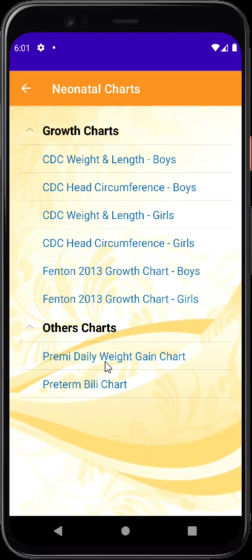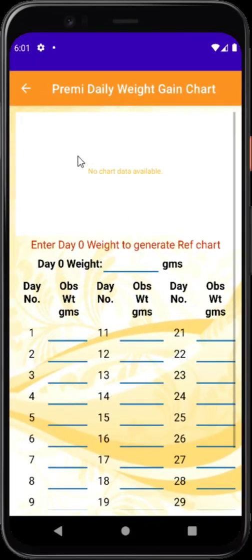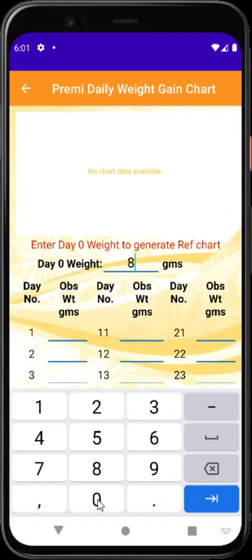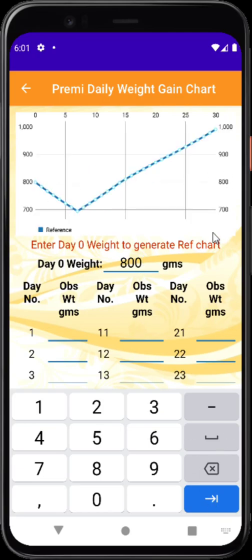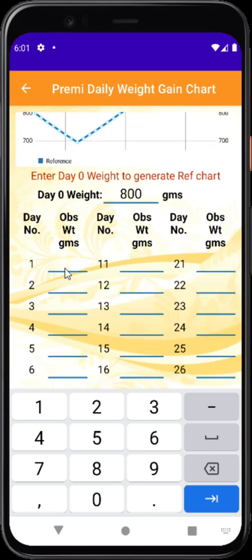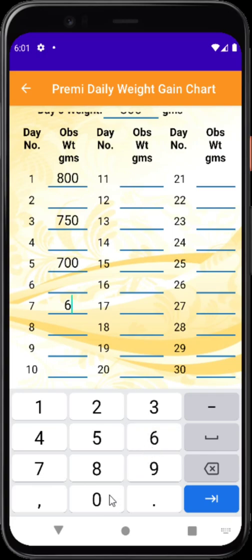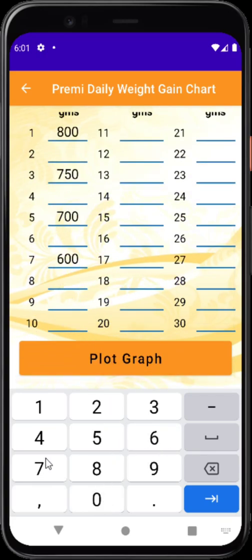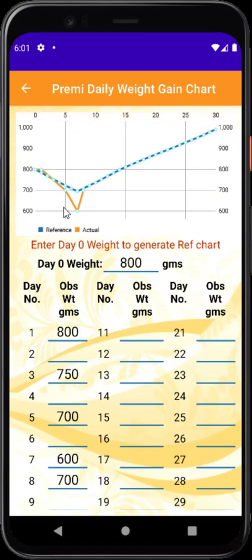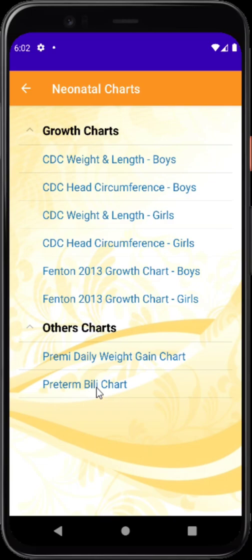To use the interactive weight chart, open the calculator — the screen starts blank. Enter the birth weight in grams — say 800 grams — and press enter to get a reference chart. Then enter weights on different days: day 1 = 800, day 3 = 750, day 5 = 700, day 7 = 600, day 8 = 700 after management. Plotting the graph shows the observed values against the reference chart, helping you understand and optimize how the child is being managed.